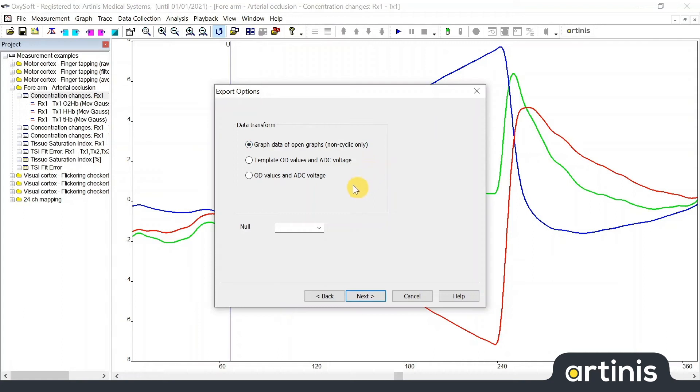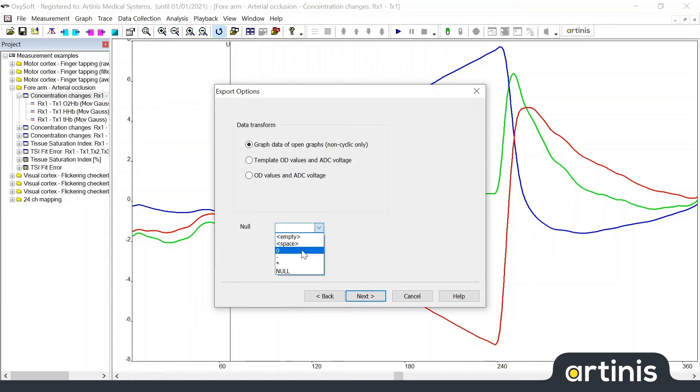Null field specifies the input for the event column for those samples where no event occurs. This can be specified by empty, space, zero, score, asterix, or null.